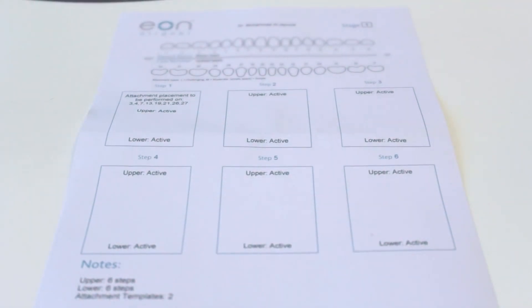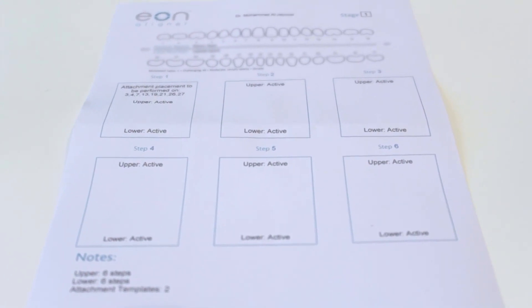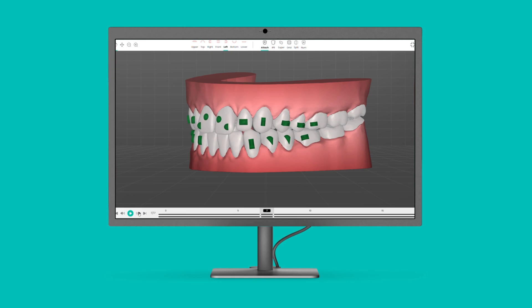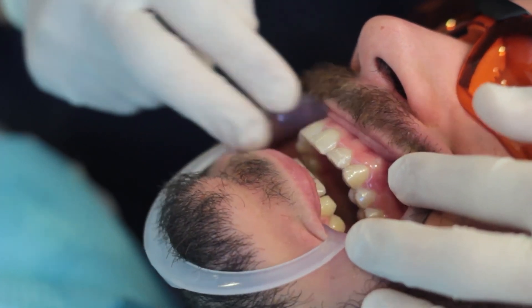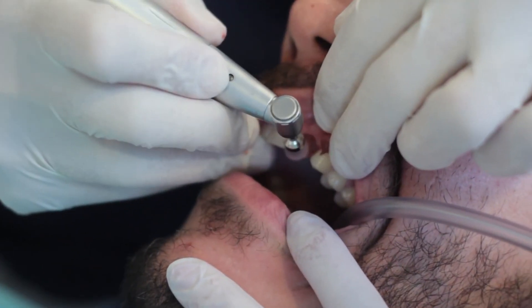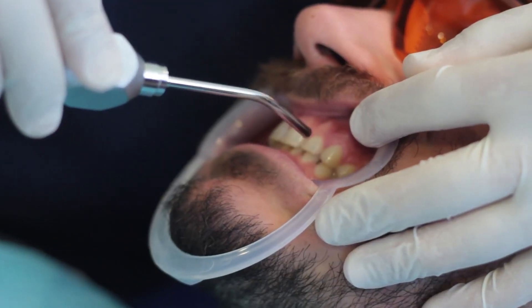Moving on to the next step. To ensure accuracy, check the number and shape of attachments provided in the template and compare them to the attachments present on the 3D viewer on EON Access. Once the fitting and attachment analysis is complete, it's time to prepare the teeth for attachment bonding. The teeth should be thoroughly cleaned, polished, dried, and isolated.